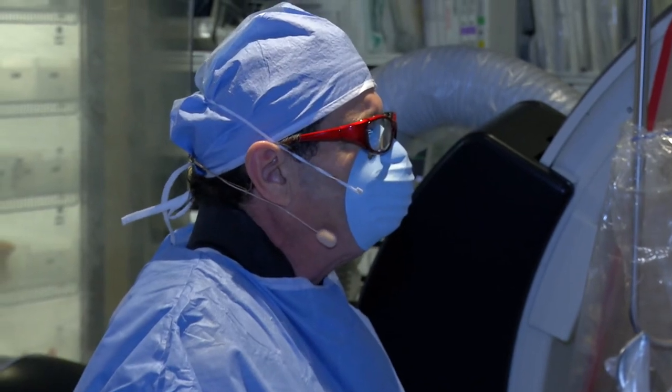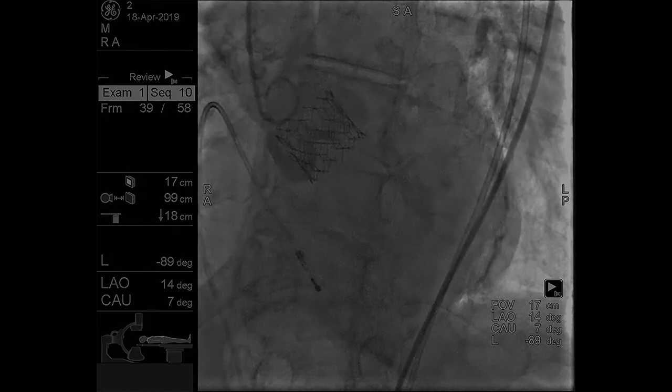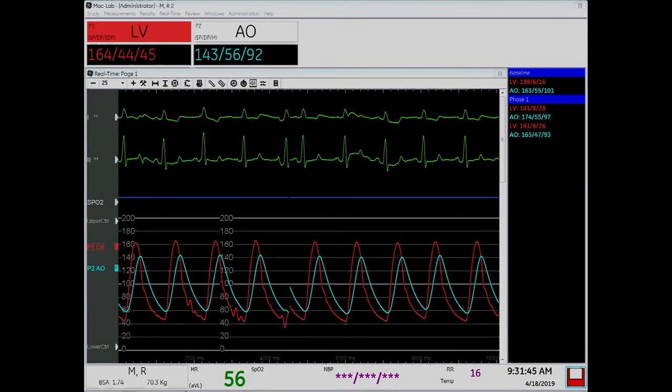I think we're going to decide to leave it, right, guys? Yeah. The diastolic pressure is already 60, it's fine. All right, we're going to leave it. Yeah. We don't want any disaster or anything. Yeah. So we're done.